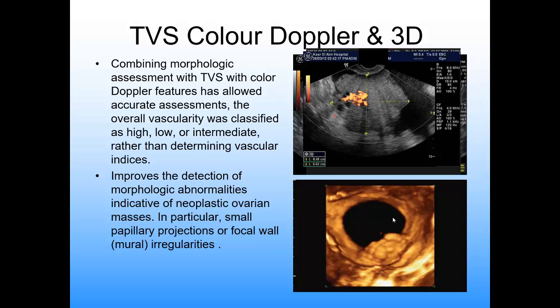But what about the 3D and 4D? Many of the clinicians request 3D ultrasound for gynecological assessment, ovarian neoplastic lesions. But it's not so; the use of color Doppler is very important. The 3D ultrasound just specifies the lesion more, but it is not mandatory. It's not the one which reaches a diagnosis.